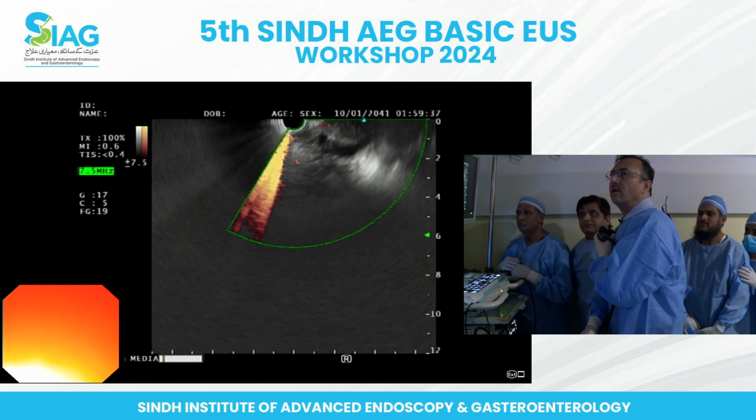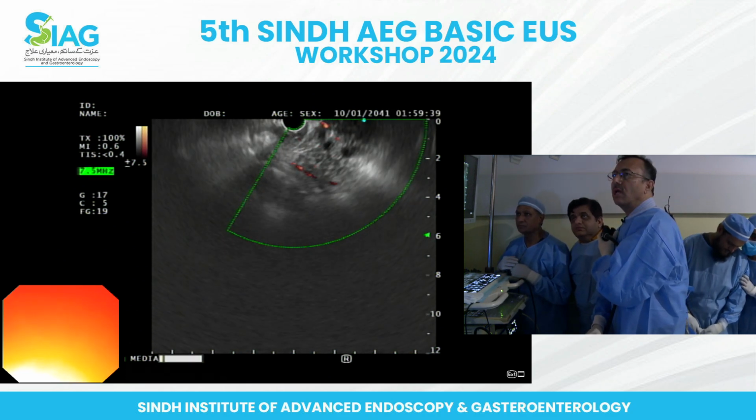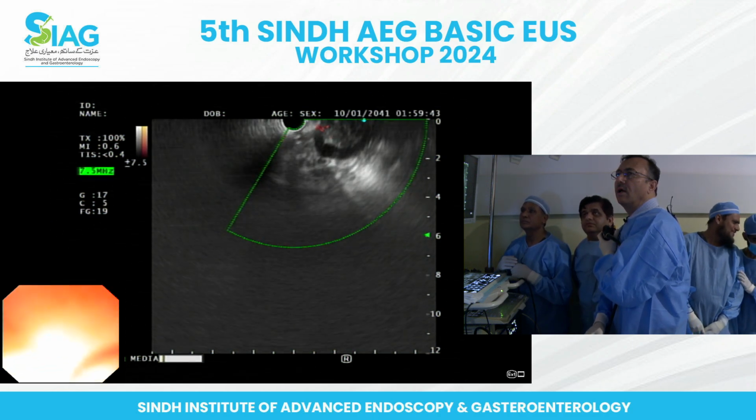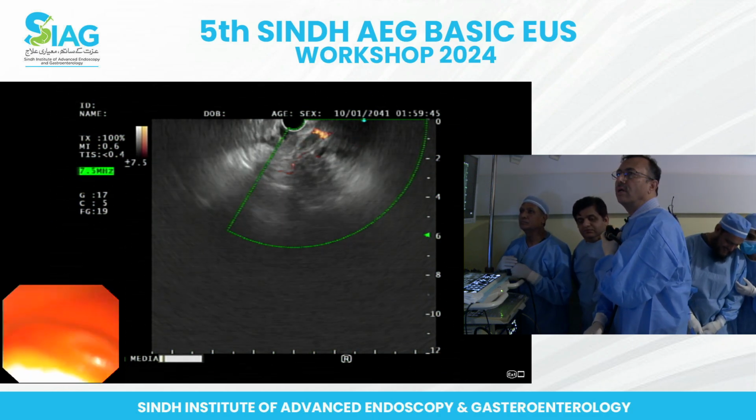Okay. This pancreatic duct has come, so slight pull back over here.